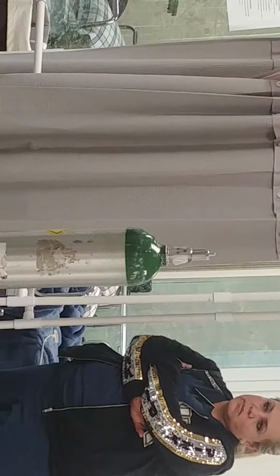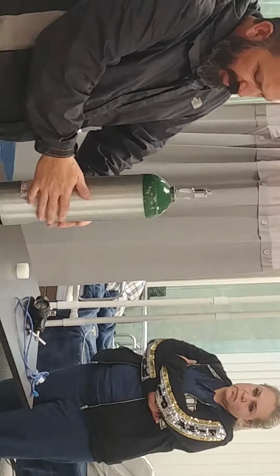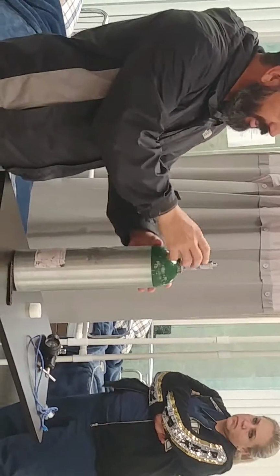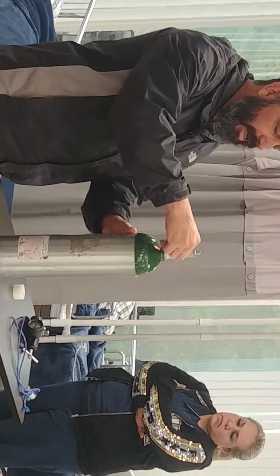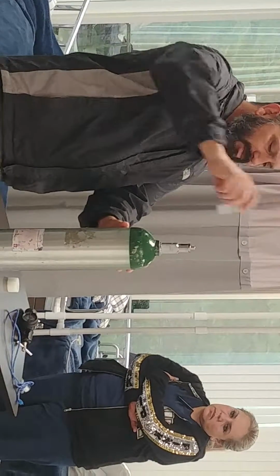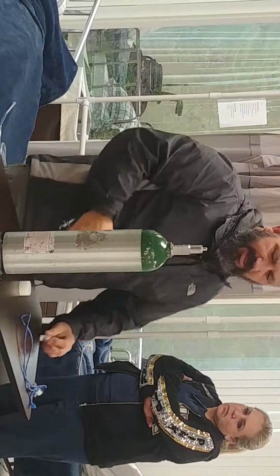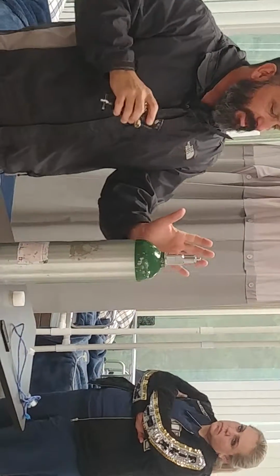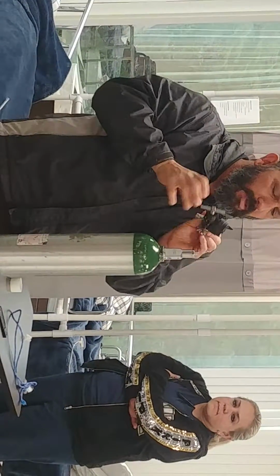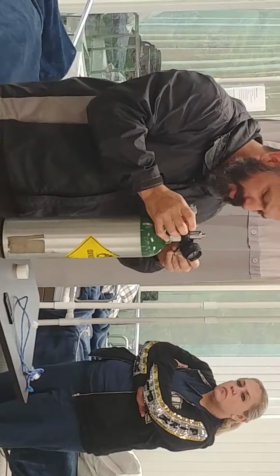When we get our new bottle, we come over here and inspect it, make sure there are no dinks, and sign it out. The first thing we need to do is tear this little tab off to gain access. We set this bottle aside for just a second, and now we have to take the regulator off the old bottle to be able to swap it out. So how are we going to do that?